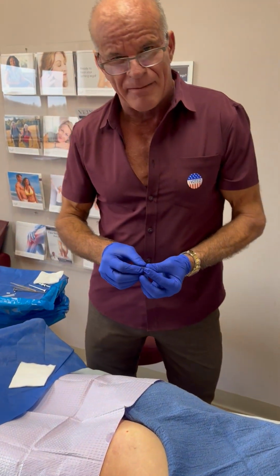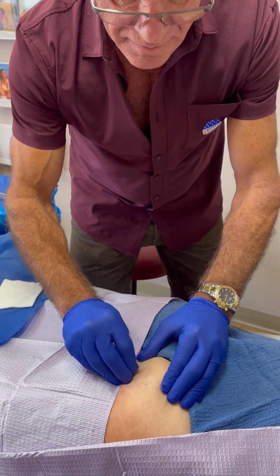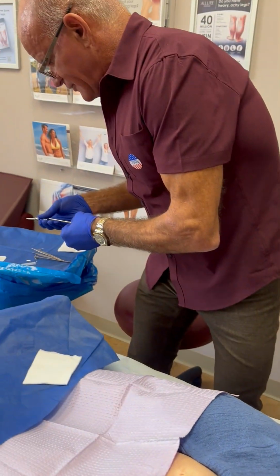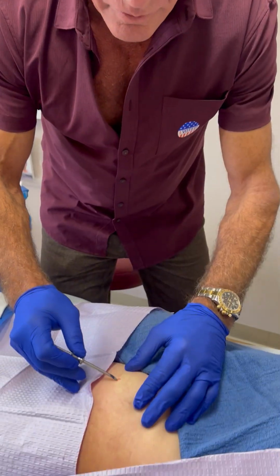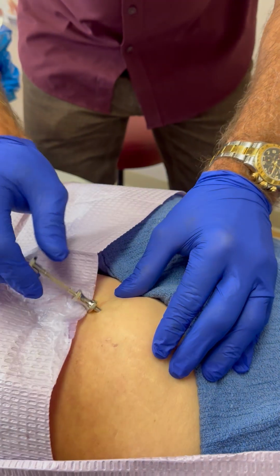I put a little anesthetic in, about 10 cc's of a diluted lidocaine with epinephrine, so there's no bleeding or bruising typically. Make a little incision. I kind of did it inside the underwear line. And I have what's called a trocar here, which I'll assemble. It's kind of blunt here, so it's angled and it's blunt. So I would go through the little incision, go down into the subcutaneous fat, nice and deep.